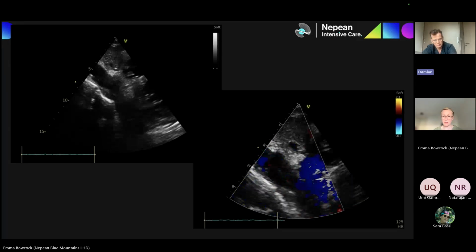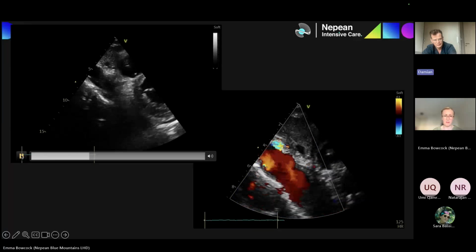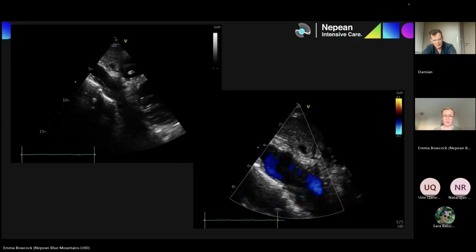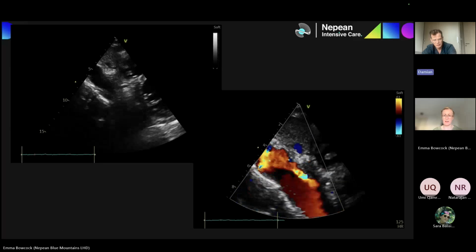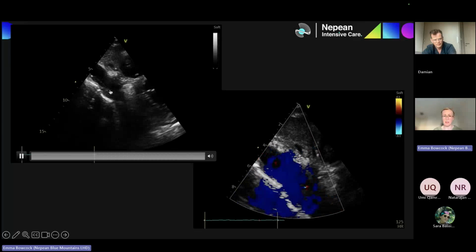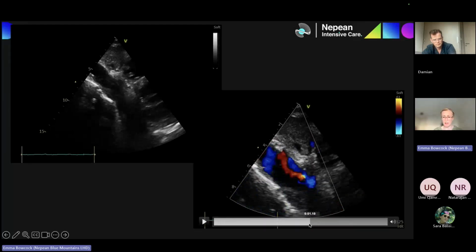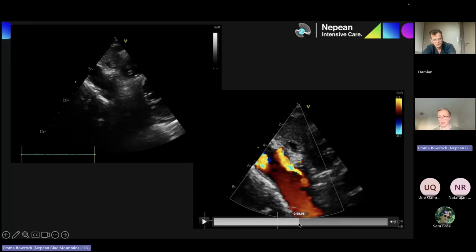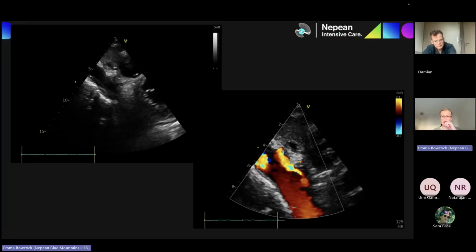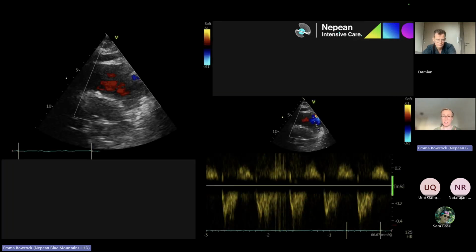There is bidirectional flow, there is regurgitant flow in the abdominal aorta on the right side. It doesn't fully fill the aorta. I wonder if we're seeing a degree of the flap there as well. Yeah, I think we've got the true lumen and then the false lumen, so the expansile true lumen, and the blood coming in the true lumen and then flowing through the little entry points at multiple parts into the false lumen. So we're seeing the flap there. Differentiating true from false, we've run out of time, but it is a thing that they could ask you to do in the exam.